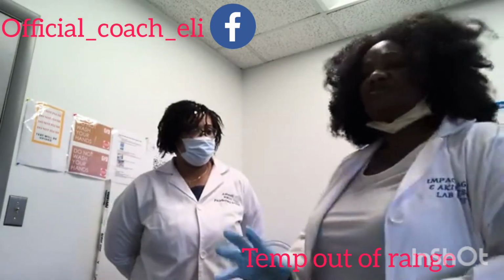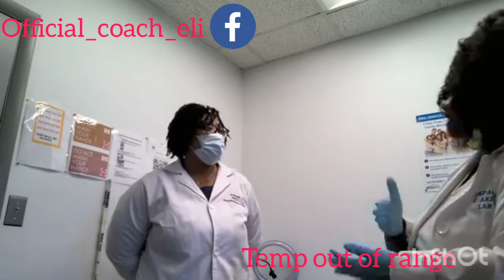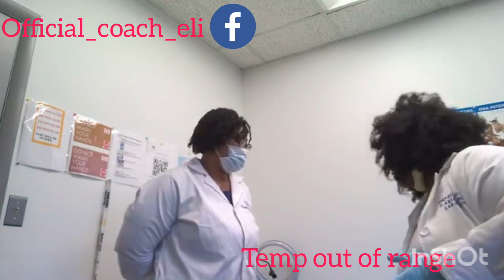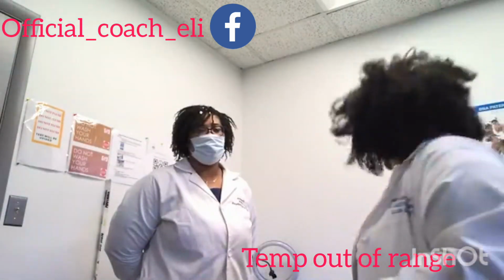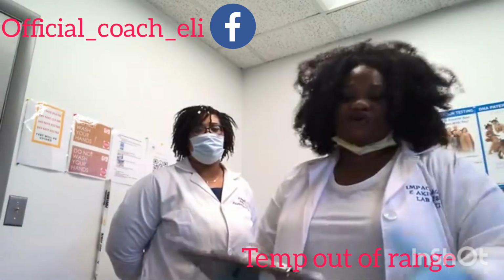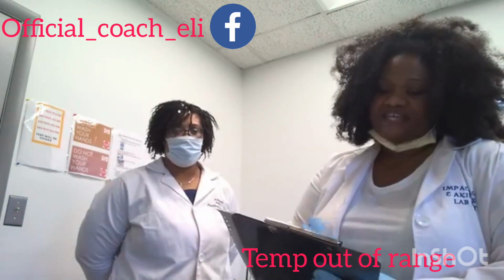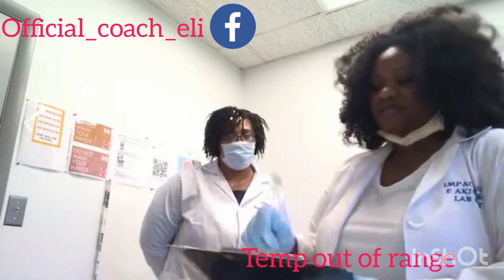But before we do, what I'll do is provide an instruction. The first test was out of range, so this is the 2 of 2 test. What I'll do is grab another specimen, another CCF form, and go ahead to complete my step 1. I already have the information, so I'll go ahead and put her social security number or ID. She's from the FMCSA. She's doing a 5 panel, and it's for pre-employment. And I'm going to stop right there.